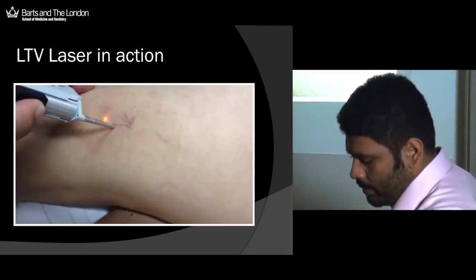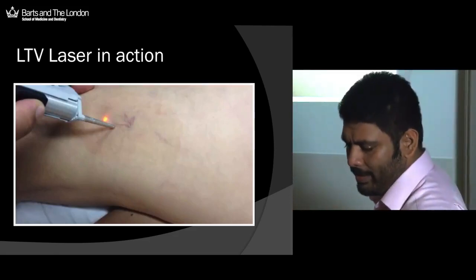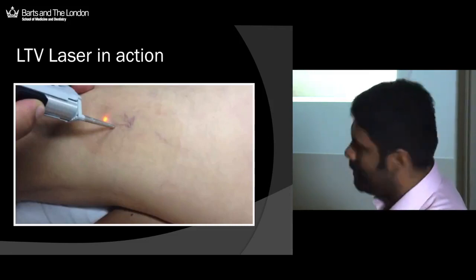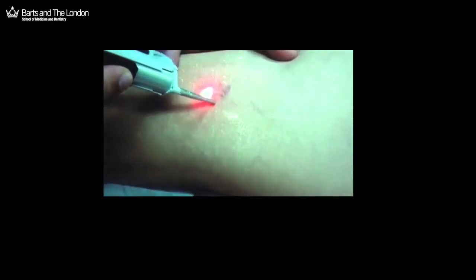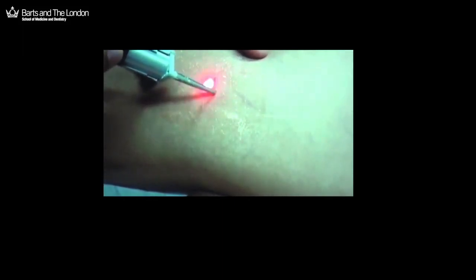Now, this is just a quick final slide to finish on, because lots of people sometimes still come up and ask me these days, Dr. Hussain, does laser work for leg veins? And I say, yes, it does. It works very well. But this is telangiectasia that I treat. This is one of my therapists who was getting very bothered by it. So straight away, it's a quick fix solution. Now, if that's not working, I don't know what is. But, you know, it's a very, very effective tool in the treatment of these problematic telangiectasia.